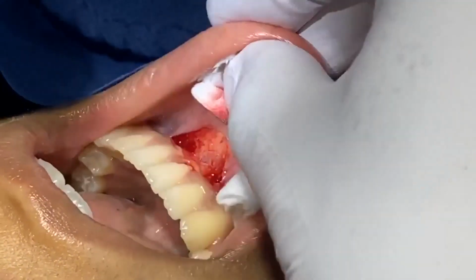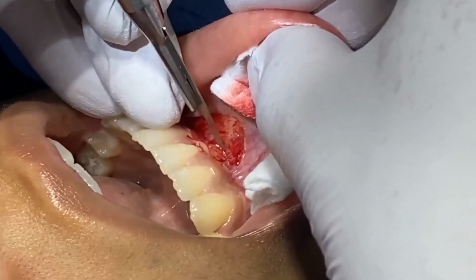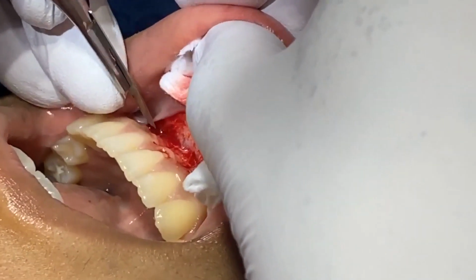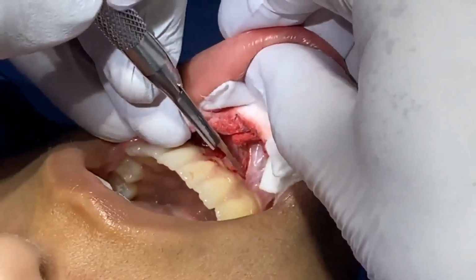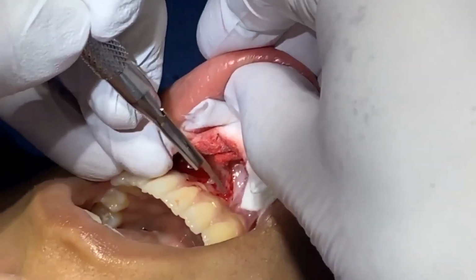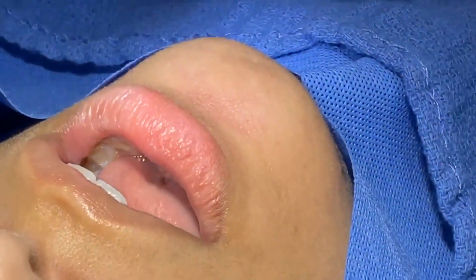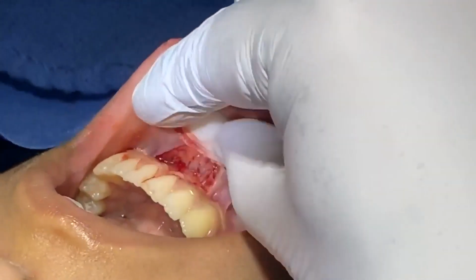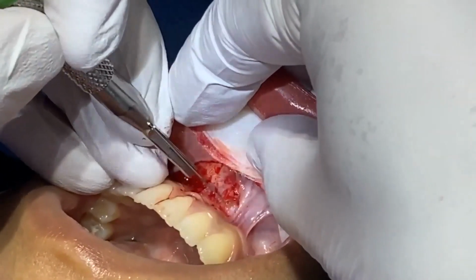Good. So what he's doing is he's scoring right at the mucogingival junction, and what's important is that he's not going all the way to the bone. He's leaving the periosteum underneath. Because when you do FGG, your major blood supply comes from the underlying periosteum, okay? Whereas with the connective tissue, the major blood supply comes from the overlying mucosa, right?